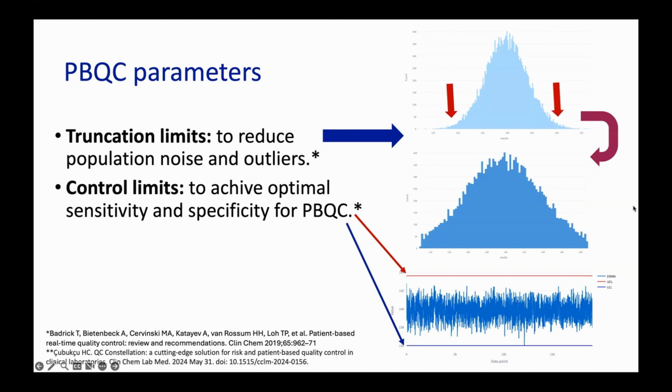In the exponential weighting moving average plot on the right, the red and blue lines represent upper and lower control limits, respectively. During the optimization process, we can adjust these control limits according to sensitivity and specificity values to achieve the best sensitivity and best specificity values.